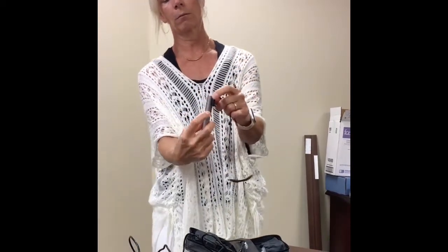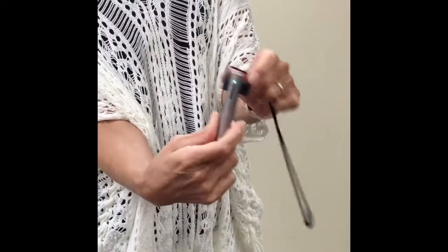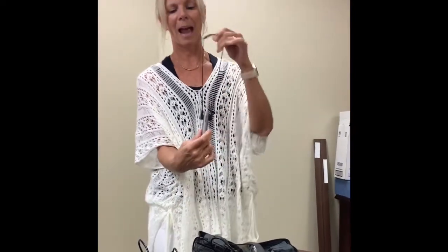But to turn the microphone on, which it should already most likely be on, there's a press and hold button right here where we press and hold, and then the light will come on. It's going to blink green, and it's going to come off and on, indicating that the microphone is active.